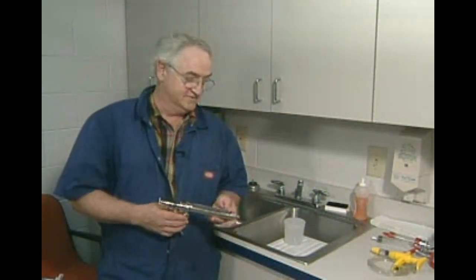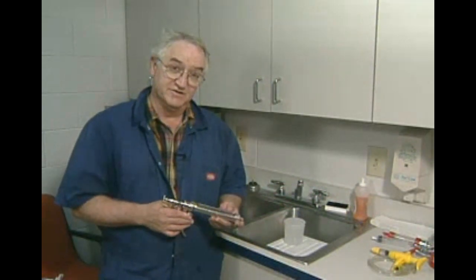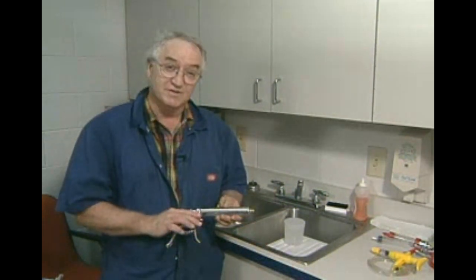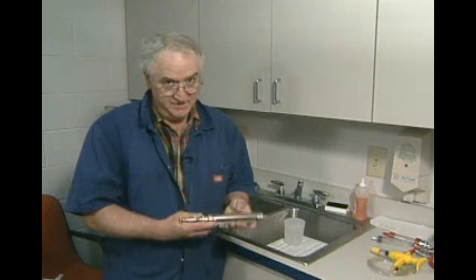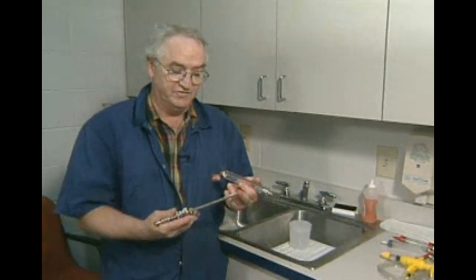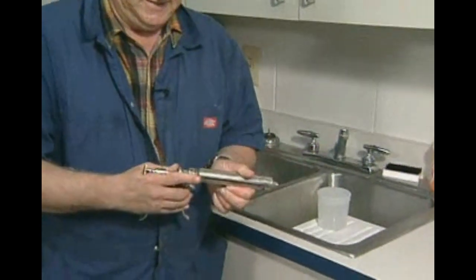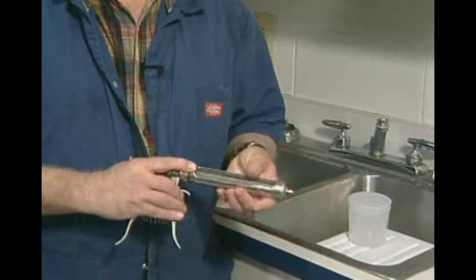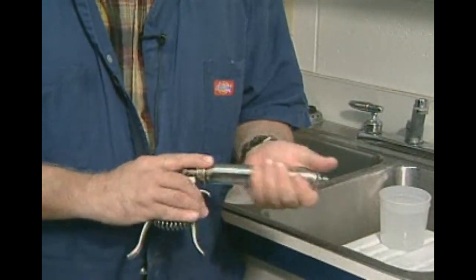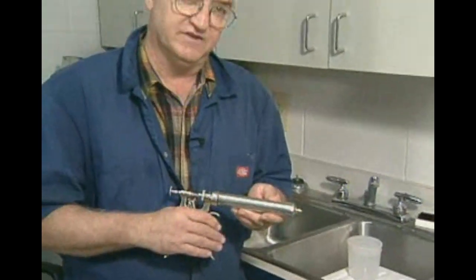We're going to talk about cleaning syringes. There are a couple of common types used in feed yards, and a third one I'm going to introduce today. The old standby metal pistol grip syringe is one of those commonly used. Everybody knows how to take them apart and clean them, but the issue is that we frequently contaminate the inside of the barrel after cleaning. Those contaminations can cause injection site lesions and make steers sick if the infection creates a disease called phlegmatous cellulitis.